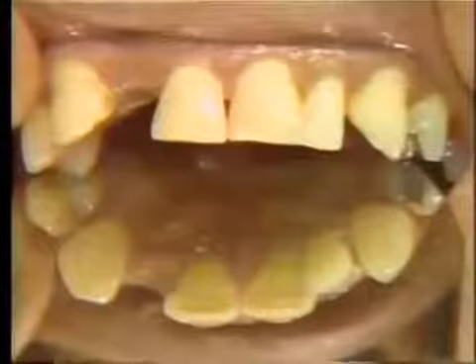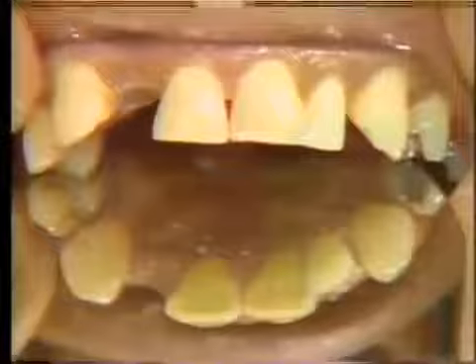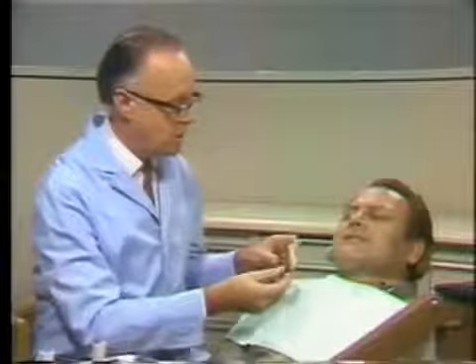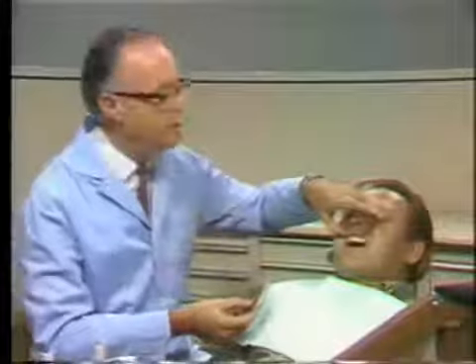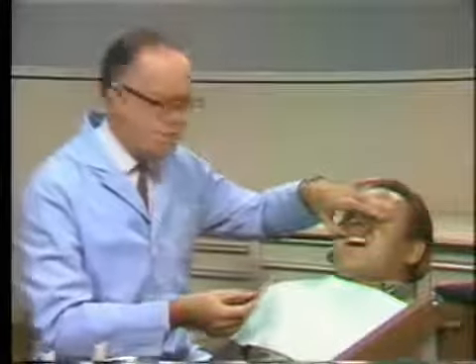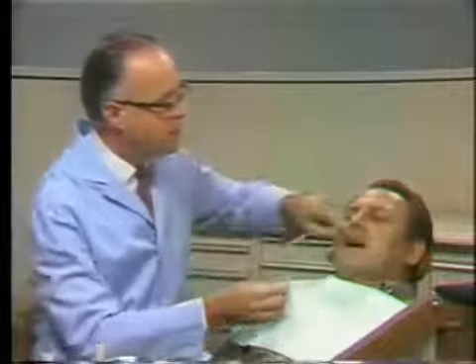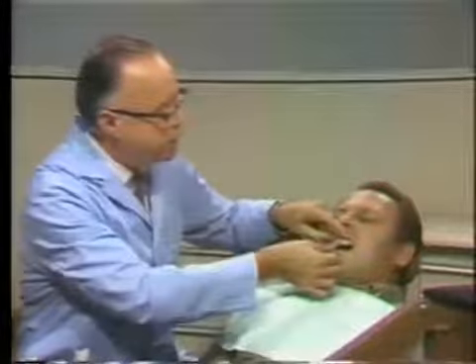and our next step is to select the shade for the Pontic facing in this particular case, and that's what we'll now do. As we're using the long pin facing for this situation, we shall use the Bioform shade guide in selecting the shade for this particular case. And from past experience of this type of situation, looking at these particular teeth, one gets a pretty good idea that it's going to be somewhere in the 66, 67 range. And so just as a trial shot, we'll select one of those and put it in position in here and take a look and see how it compares with the teeth on either side.